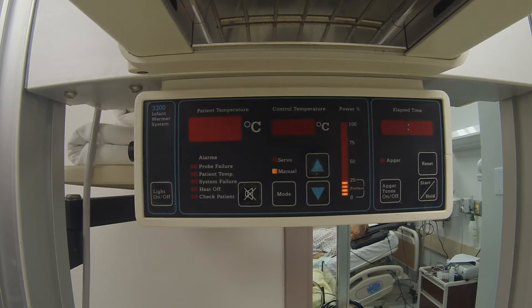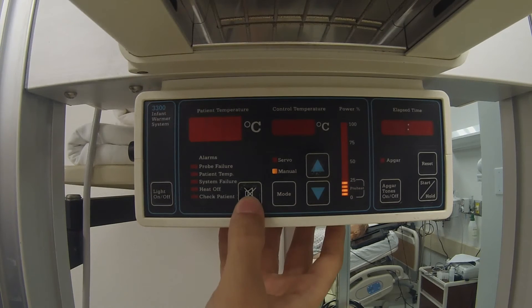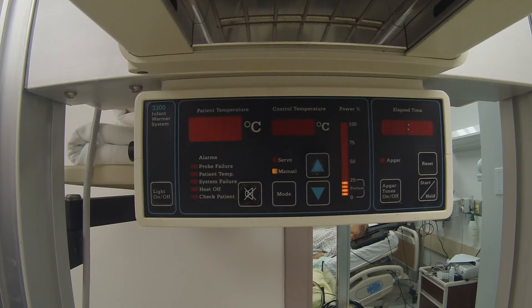While in manual mode, the unit will chime in 12-minute intervals to remind caretakers to monitor the patient's temperature. To silence the alarm, press the alarm silence switch. If the alarm silence switch is not pressed within 3 minutes, the alarm will switch to an alternate 2-tone sound and it will depower the unit as a precaution.